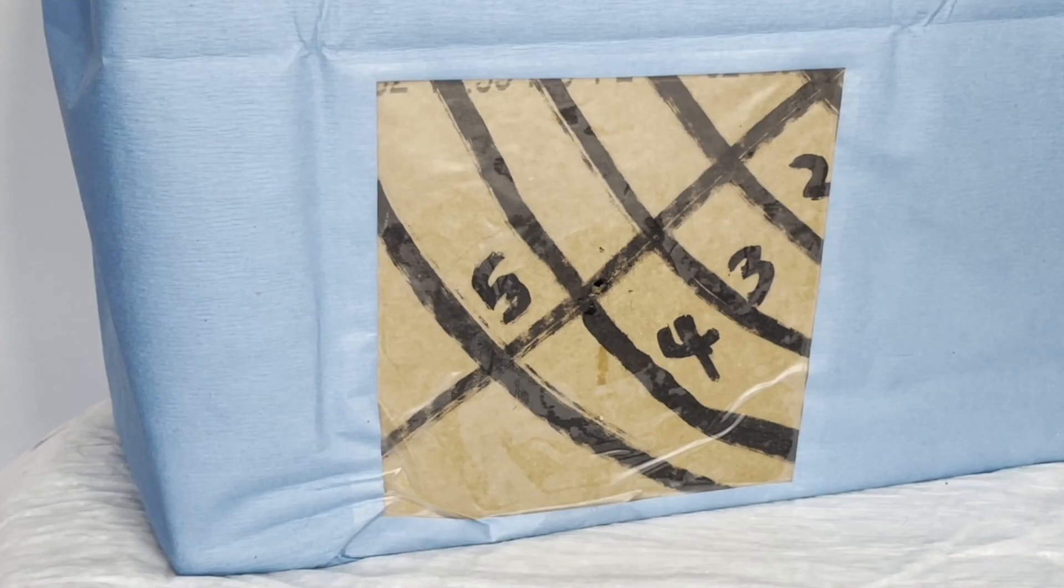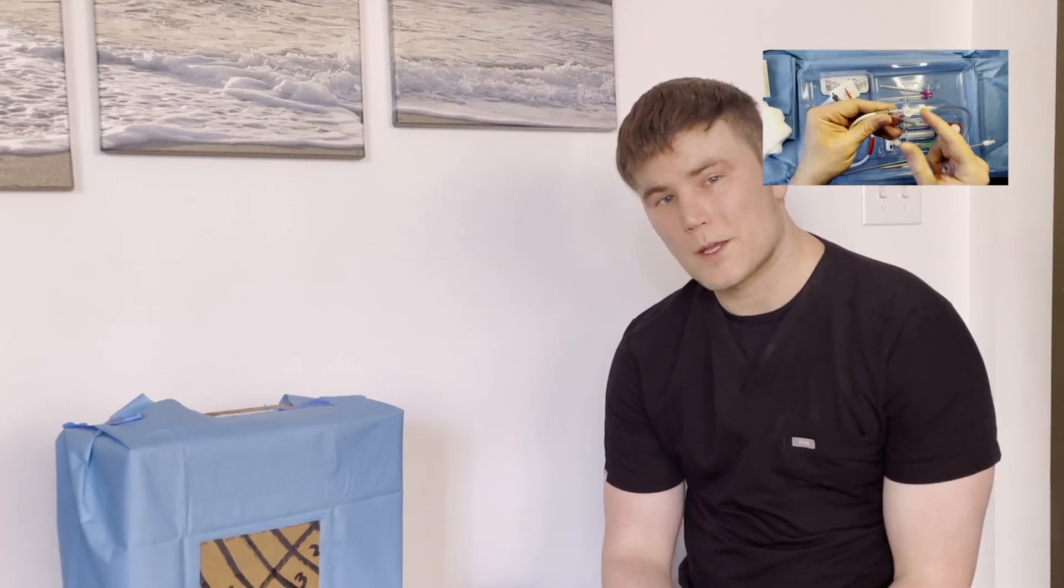Welcome back to another tutorial video. Today we're going to be showing you how to insert a pigtail catheter into our mock patient here. The last video that we did shows you what's inside the pigtail catheter kit and what to expect. So if you need to reference that video, go back and watch it.